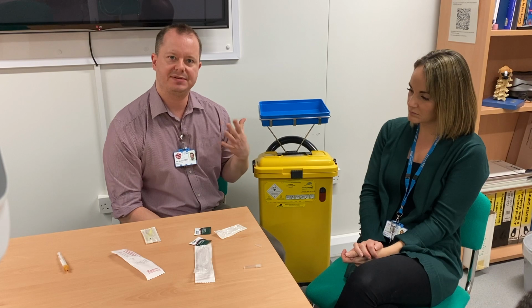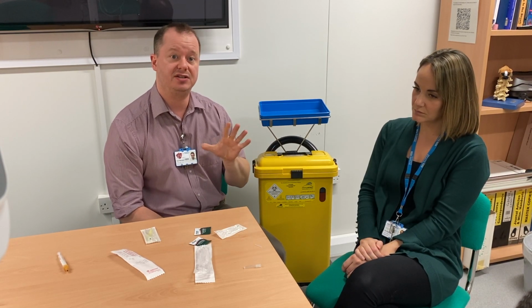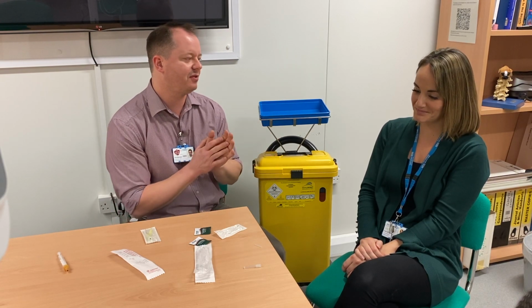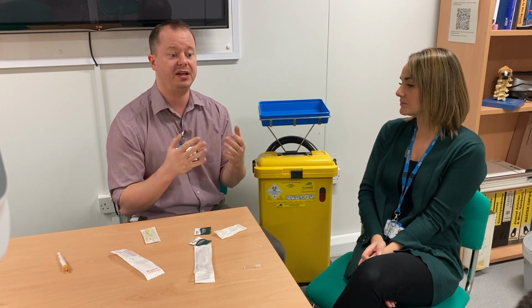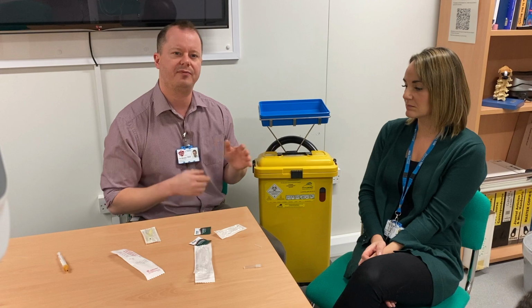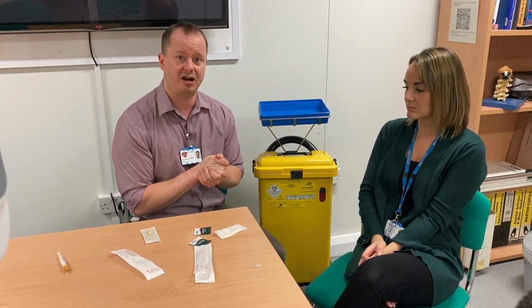If the worst does happen and you receive a sharps injury, there are some important steps to take, which we'll go through now. The first thing you need to do is make sure you dispose of the sharp. We've got several documented cases of people who, in their panic, have injured themselves further, or another member of staff. We don't need that sharp device anymore, we don't want to test it, it needs to go just into the sharps bin.